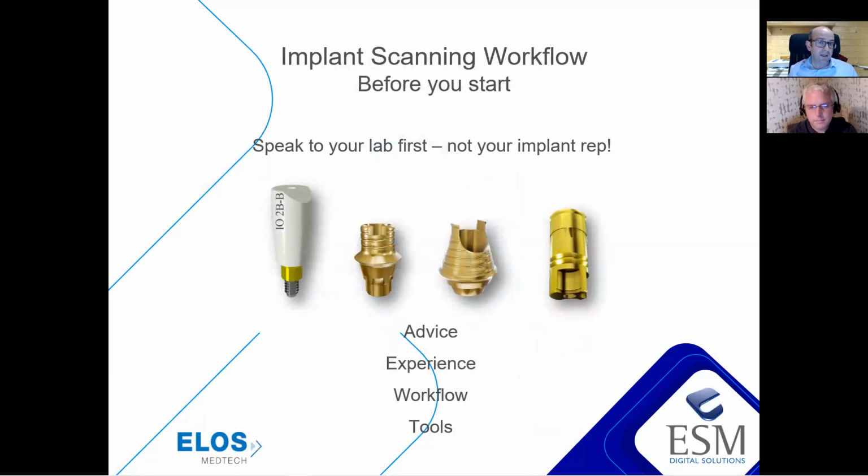So let's take a look at an implant scanning workflow. So before you start, if you're new to intraoral scanning, or maybe you've got experience and you're now new to implant workflows, the very first thing you need to do is speak to your lab. It's very often dentists speak to their implant reps, which is a natural first point of contact. Get some components, do a scan, send it through to the lab, and then the lab comes back and says, I can't deliver that restoration request that you have. So the first thing you should do is speak to the lab.